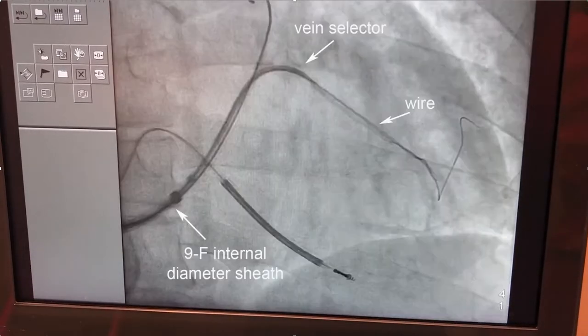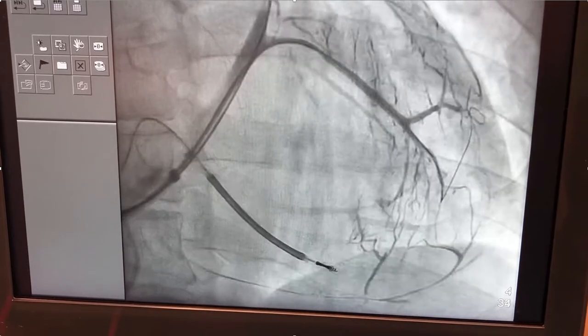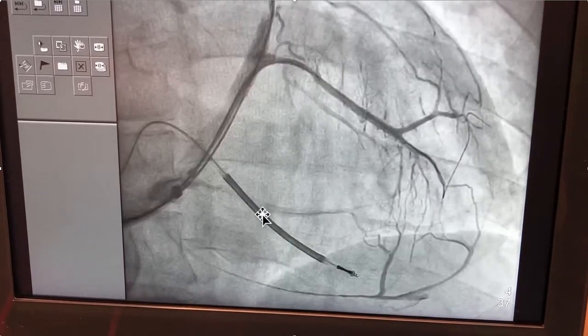So we go up and engage the initial target branch with a vein selector, and we have the whirly sheath here with a wire. We'll do a venogram using the vein selector injecting around the wire, and now we see another branch.